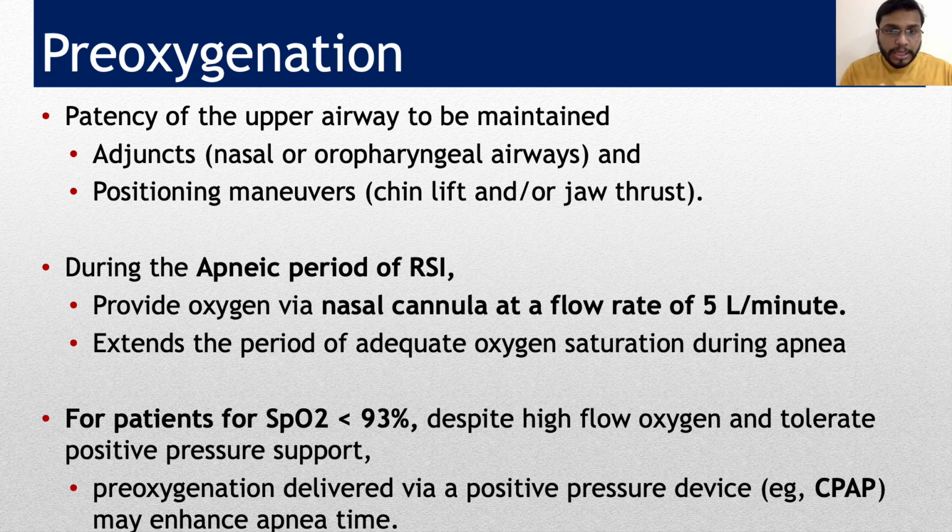So as I told earlier, it is not always bag and mask ventilation. That's the key point I want to convey in this slide. You can use bag and mask ventilation in certain criteria, which will come in the next slide, but you can also consider proper vital capacity breaths if the patient is cooperative. You can make sure the patient is given oxygen with a non-rebreather mask if the patient is tolerating that. You can even consider positive pressure ventilation if the patient is able to tolerate it.